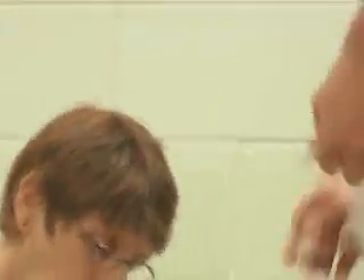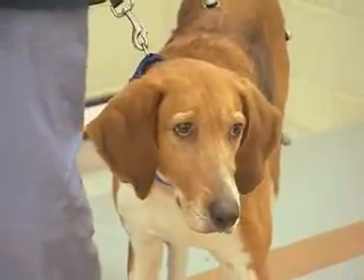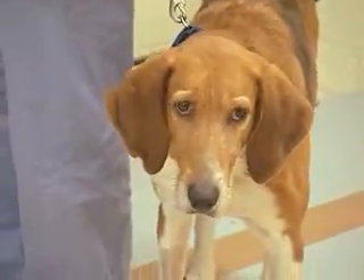She thinks the device could eventually return mobility to animals that otherwise might be subjected to invasive hip replacement surgery or lifetime medication. Some of these medications are a little bit harder on the liver and the kidneys as they're cleared from the body, so if you can reduce that load on the patient, this may be quite helpful for them.